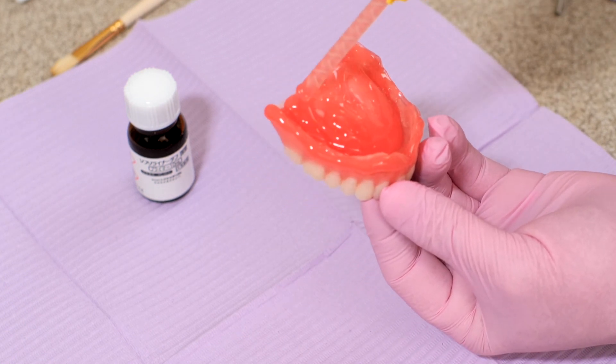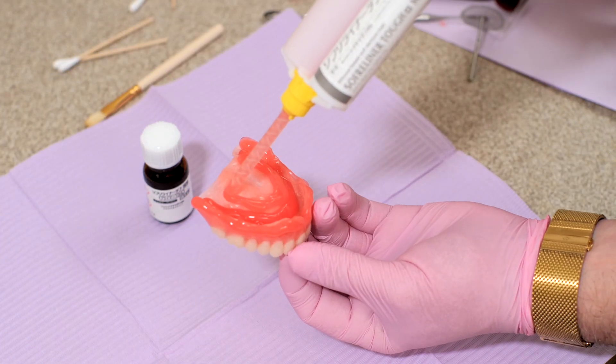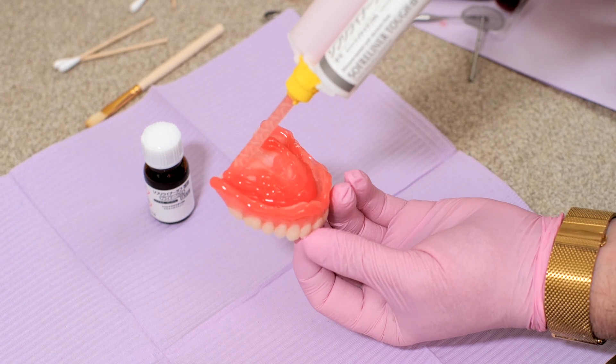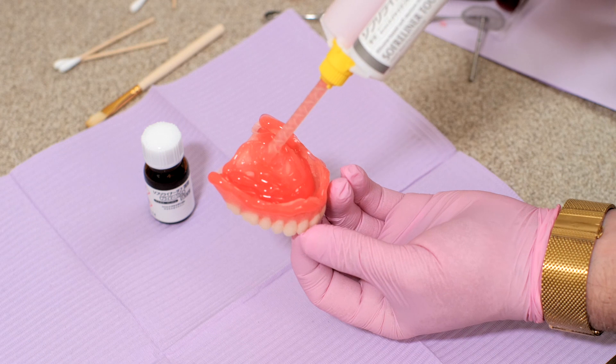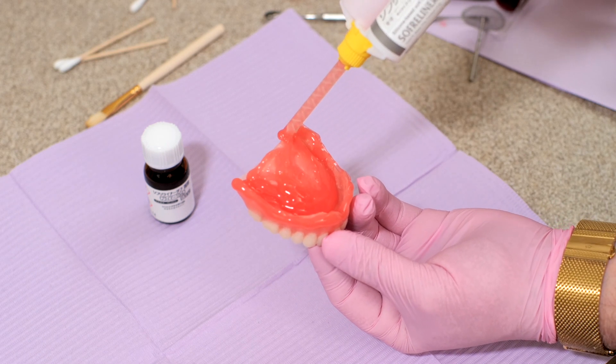And under application is a huge problem because you can't add this material to itself, so you'd have to do it over again. So make sure you use an adequate amount of material to cover the entire denture base, but not so much that it interferes with the patient's breathing or causes them to choke.